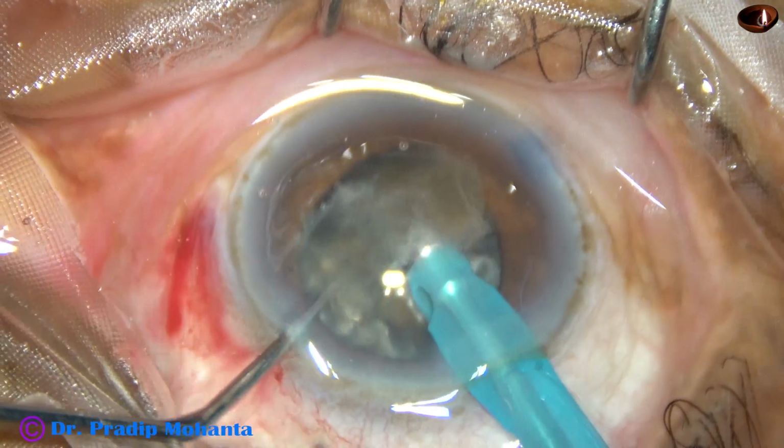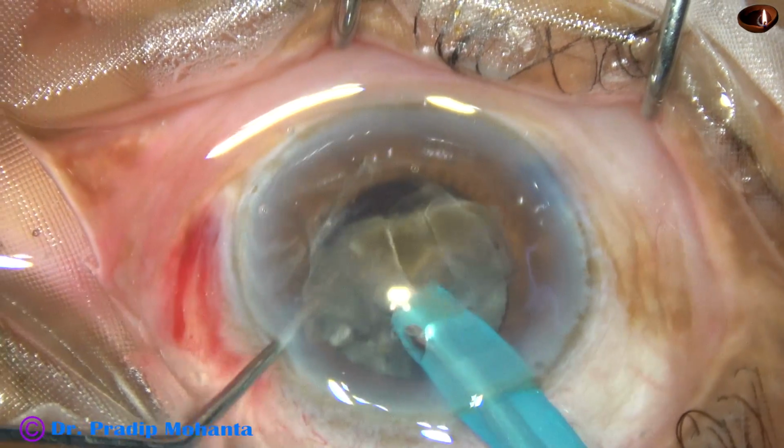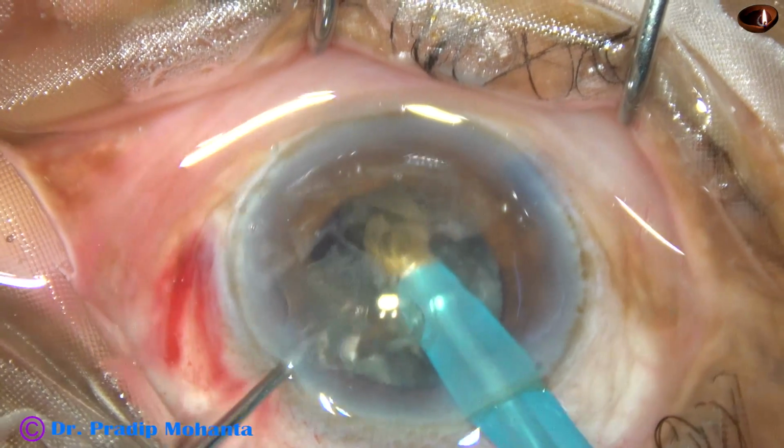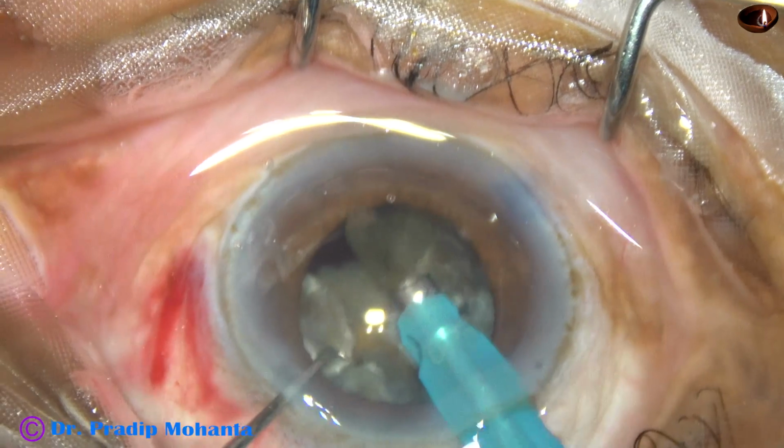The ultrasonic energy is set at 80% and in continuous mode. I am applying ultrasonic energy only when the tip is occluded and intermittently.